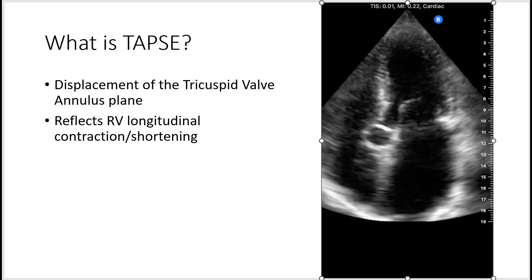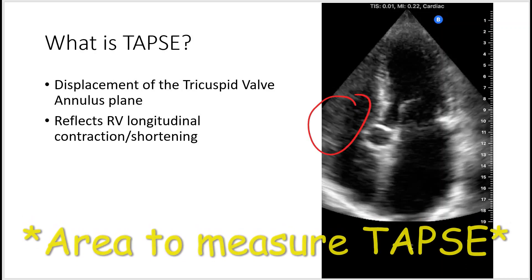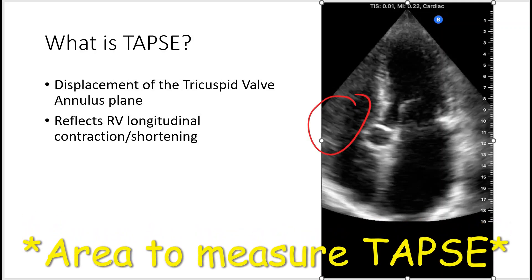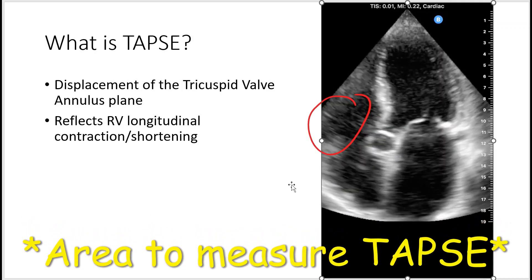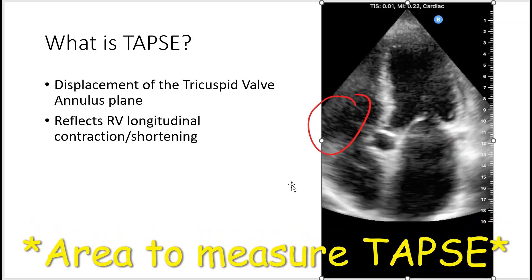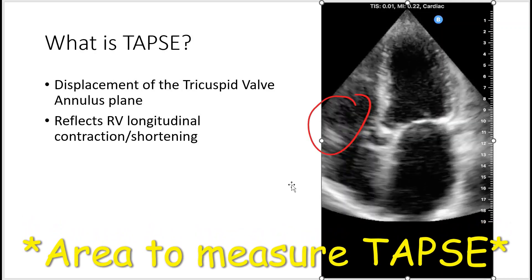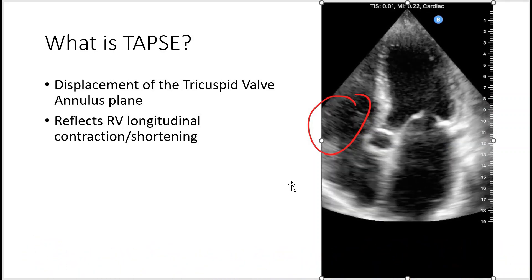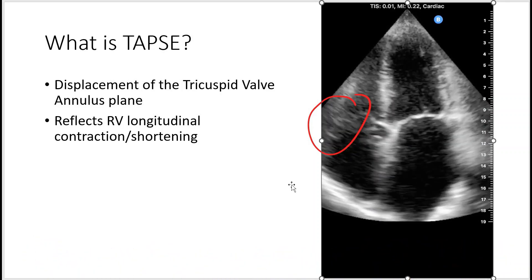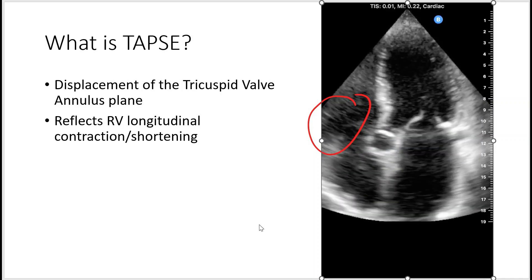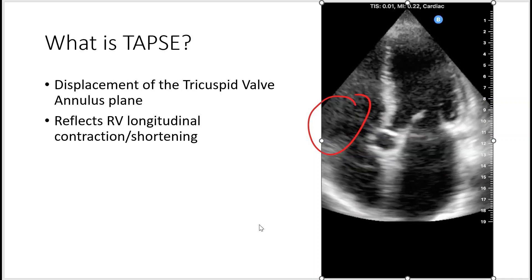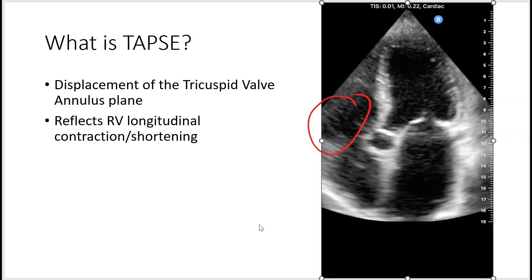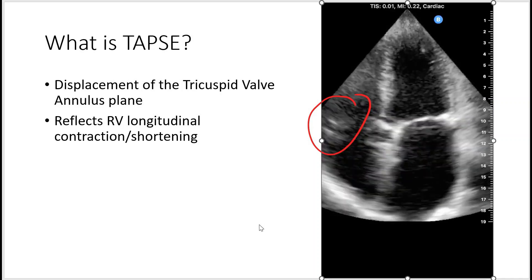This area is where the TAPSE is located, near the tricuspid valve. And as you can see, as the heart is in systole, or contracts, the wall gets shorter.